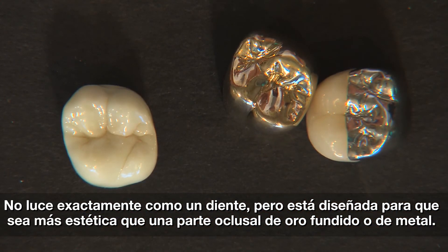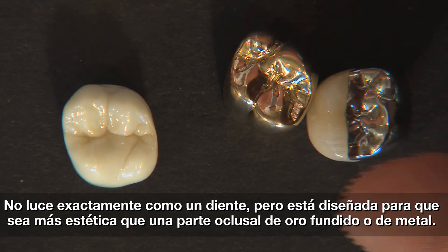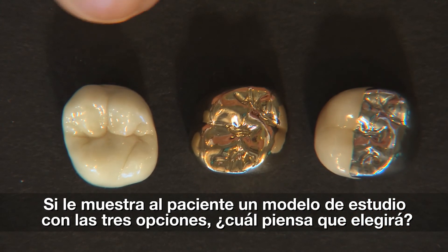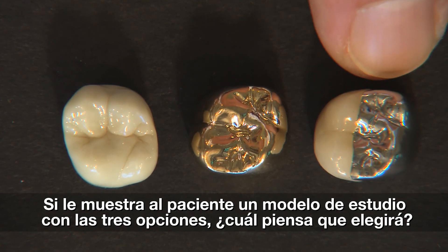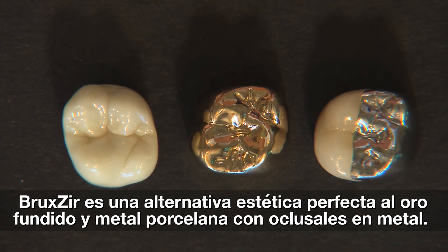Now, if you look at this, it doesn't necessarily look exactly like a tooth — and I'll show you some pictures in just a second of some BruxZir crowns in the mouth — but that's not the point. This crown was not designed to be an aesthetic crown. It was designed to be more aesthetic than cast gold and more aesthetic than a metal occlusal. And if you had a study model with these three crowns on it and told your patient they could have their choice, what do you think the chances are that they're going to take the BruxZir, even if it doesn't match the first molar in front of it perfectly? BruxZir's primary indication, in my mind, is when you want to place cast gold in a patient's mouth and the patient simply won't accept that. BruxZir is a fantastic restoration in cases like that.